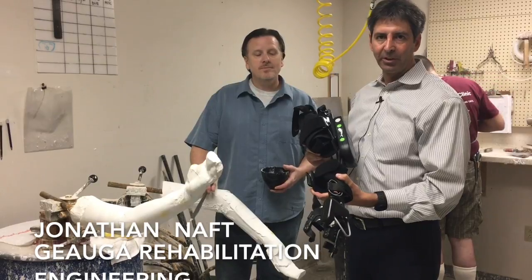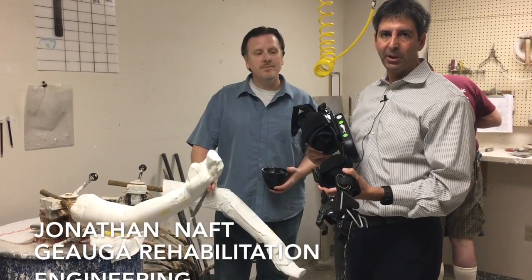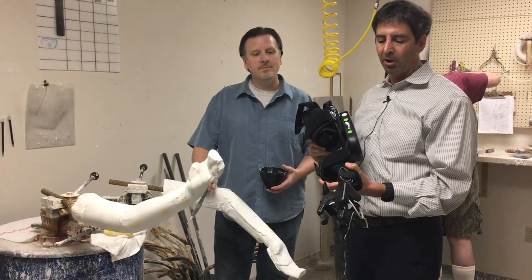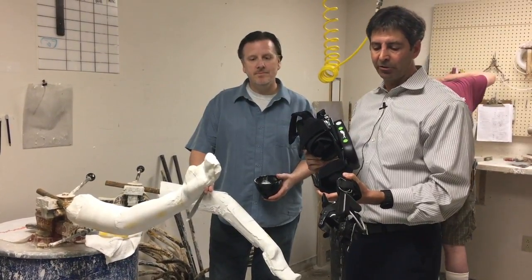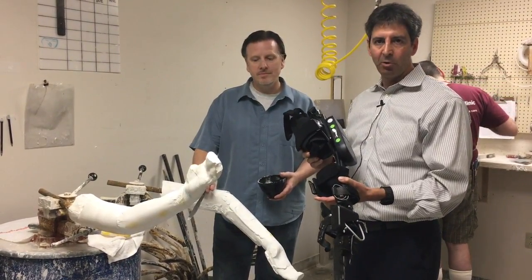This is a MyoPro Orthosis. This device is designed for patients who can't use their arm. It needs to be supported with a brace, and they have paralysis which is remediated by the motors on this brace.